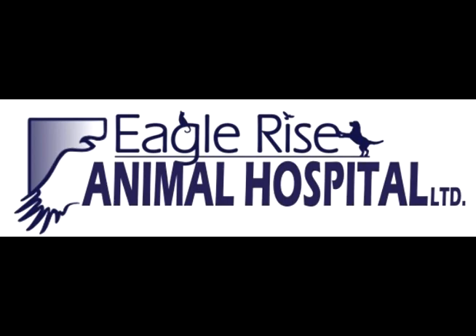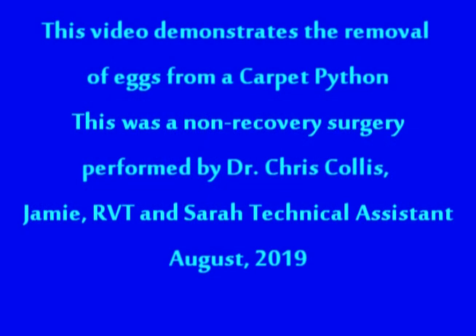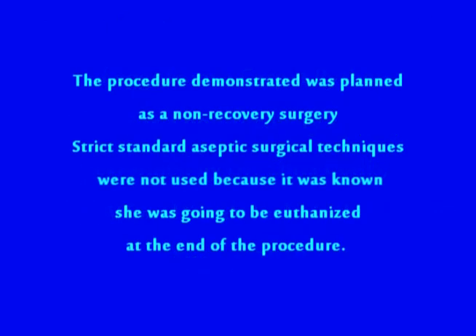In this video, we demonstrate the removal of eggs from a carpet python. This is a non-recovery surgery performed by myself as well as two of our technical team members. As a non-recovery surgery, our strict standard aseptic surgical techniques were not used because it's known that she'd be euthanized at the end. It is somewhat graphic, so we do recommend that viewer's discretion is advised.